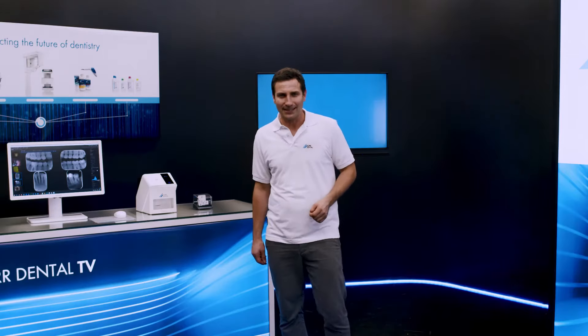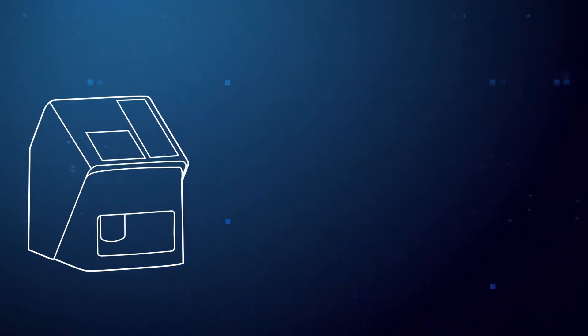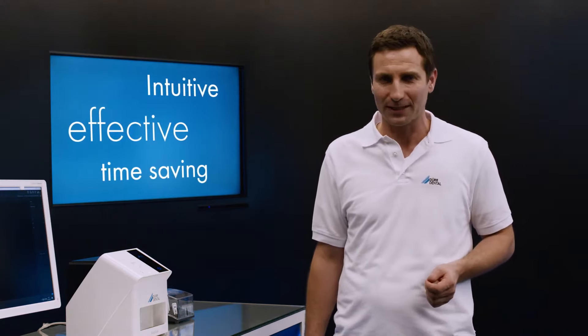Today, I'm delighted to introduce to you the VistaScan MiniEasy 2.0. The VistaScan MiniEasy 2.0 provides very intuitive, effective and time-saving digitalization of image plates. It keeps the strengths of its predecessor model, VistaScan MiniEasy, which has been successful in the market for years, and adds new, strong and innovative features.